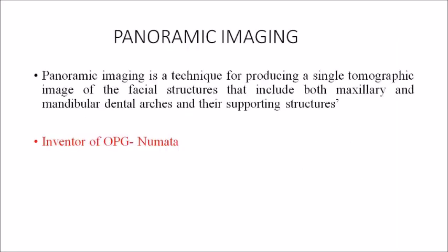The next one is panoramic imaging. Panoramic imaging is a technique for producing a single tomographic image of the facial structures that includes both the maxillary and mandibular dental arches and their supporting structures. NUMATA is the inventor of the panoramic radiograph, also known as the OPG.